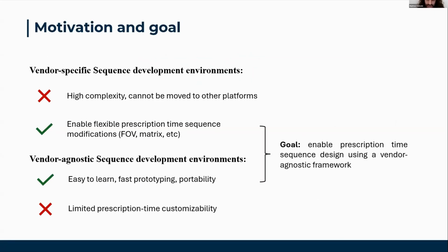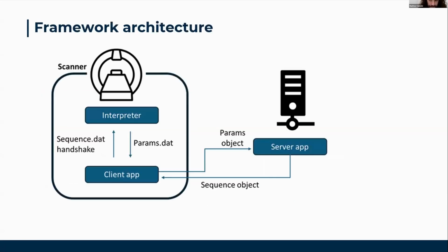The goal of this work was to bridge this gap, enabling prescription time sequence design using a vendor-agnostic framework. And we chose Pulseq as it is currently the most popular open source sequence design framework available. To achieve this goal, we proposed a TCP/IP client-server architecture.